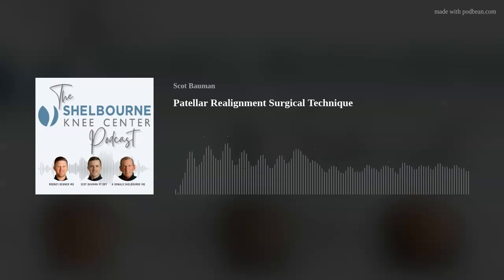Dr. Shelbourne underwent an evolution over time on fixation techniques. When he first started, he was doing a single screw in the tibial tubercle, one proximally, but distally, then sometimes it would kick up. So he eventually figured out that the more tension side of that osteotomy fixation is the distal portion of the tibial tubercle osteotomy. So he started putting a second, more distal screw. When that happens, sometimes he would still have a stress riser and would not get good cortical apposition and filling into that distal portion of the osteotomy.